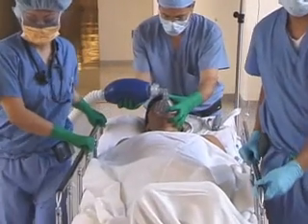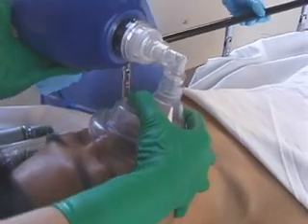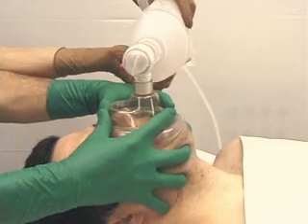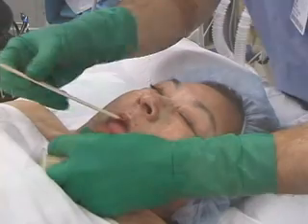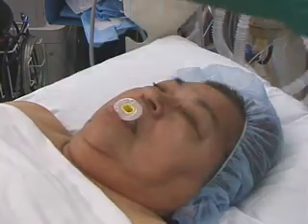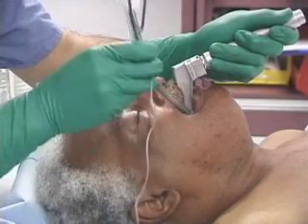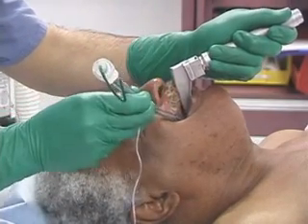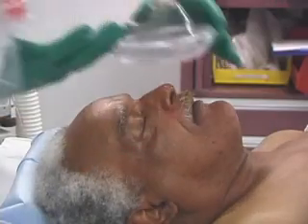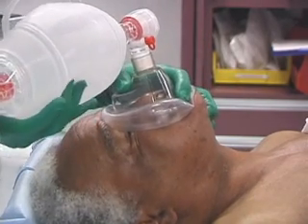Providing positive pressure ventilation with a face mask and a bag valve device can be a life-saving maneuver. Although seemingly simple, the technique requires an understanding of the airway anatomy, the equipment, and the indications. Developing manual skills is necessary to provide adequate face mask ventilation. While endotracheal intubation is frequently the definitive airway management approach for patients in respiratory failure, it is not always feasible. In these circumstances, ventilating a patient with a face mask can be an invaluable temporizing measure.